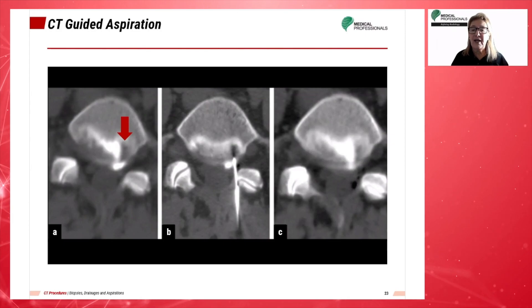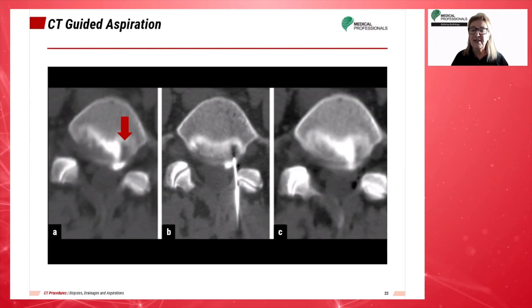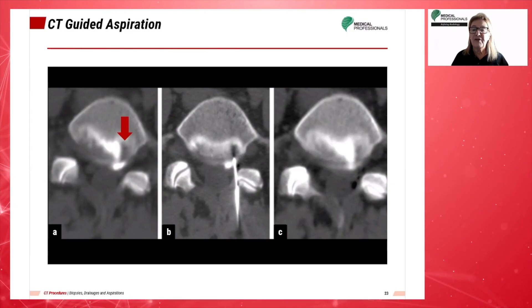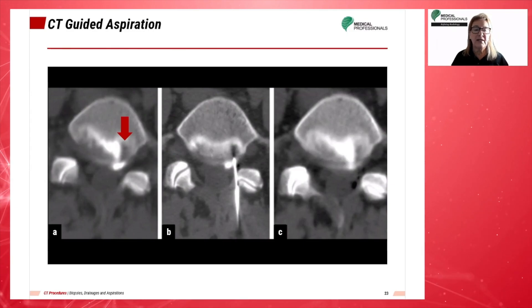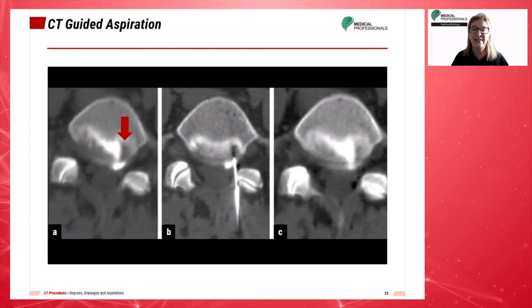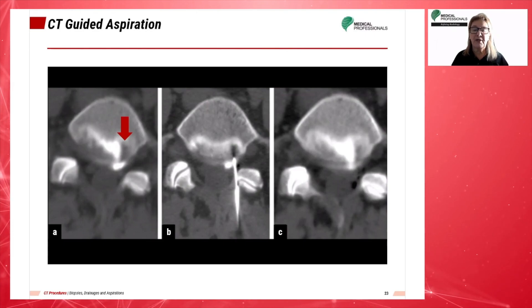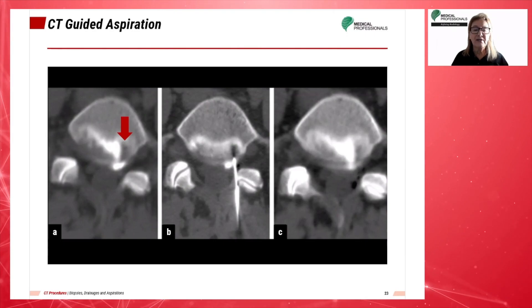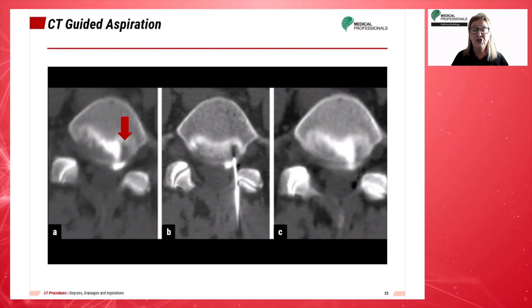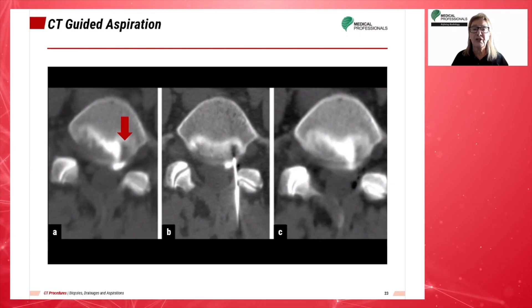These transaxial CT scans taken at the L5-S1 level show us: prior to the CT-guided aspiration, the discal cyst visualized as hyperdense in image A. After CT-guided needle placement, which we can see in the middle image, the contents of the cyst were aspirated. In the image on the right, we note the cyst is substantially smaller.